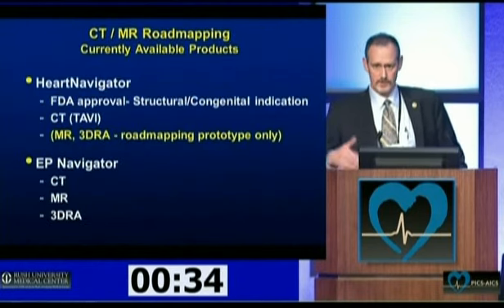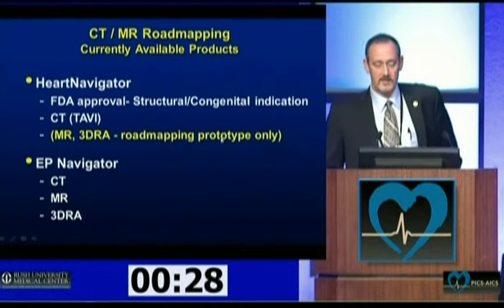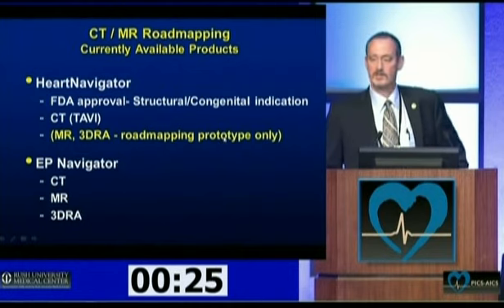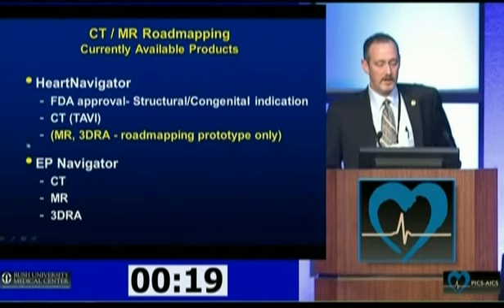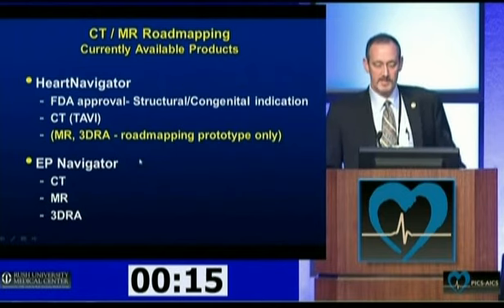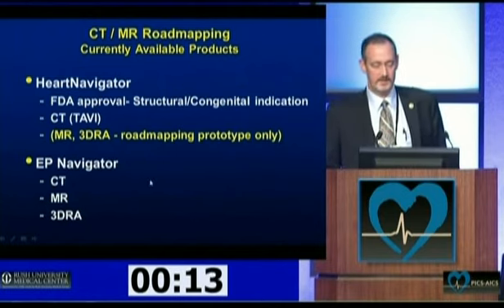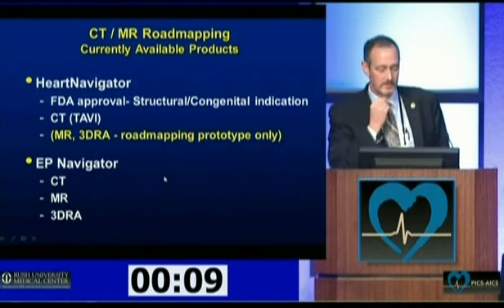Just to let you folks know, as we move through this then, Heart Navigator is FDA approved at this point, and it has indication for both structural and congenital indications. And its main indication is for TAVI work, and it's for CT, and that's what it's supported for right now. MR and 3D, which we've got the capability of performing in our lab, is still a prototype, but the long-term plan is to have Heart Navigator as the system to use as they move forward.